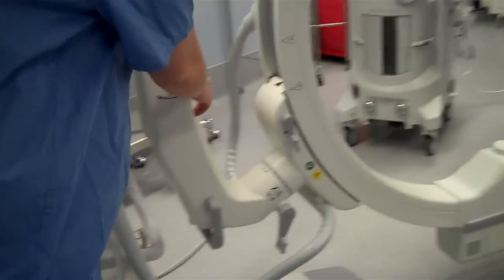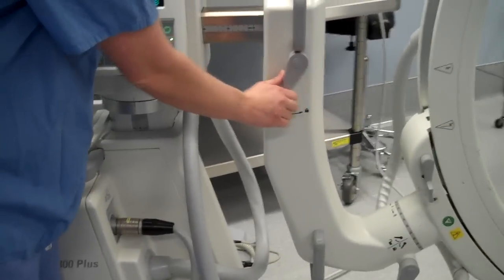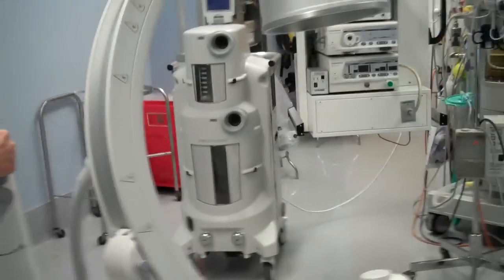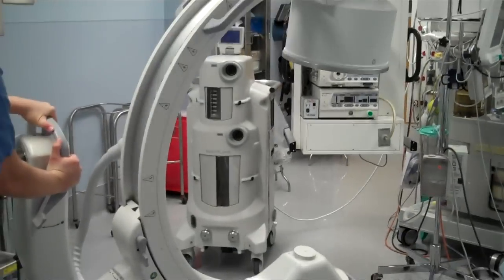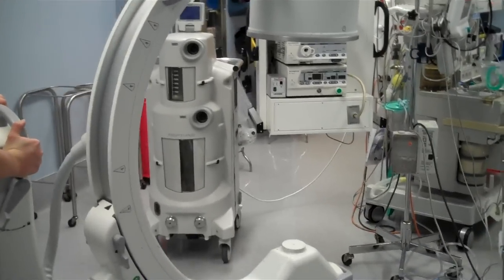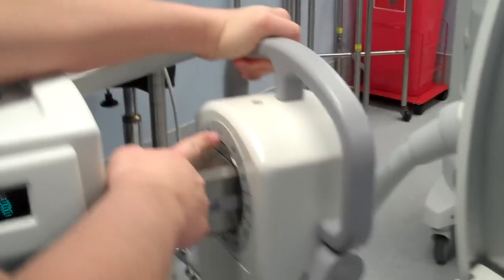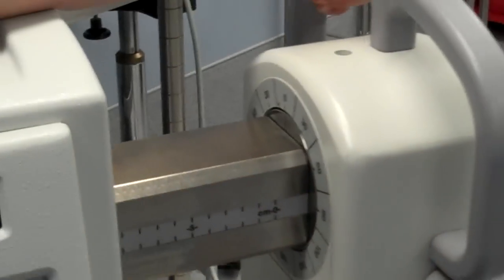This is the cephalocaudal lock right here. It allows you to angle the whole arm cephalad and caudad. To zero out this one, I'm looking at the hash marks written right here and I'm lining that up with the line right there. I'm going to re-lock it.